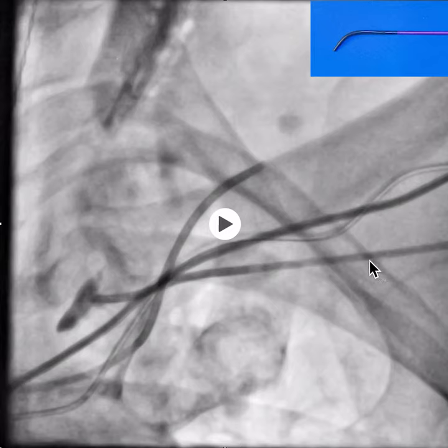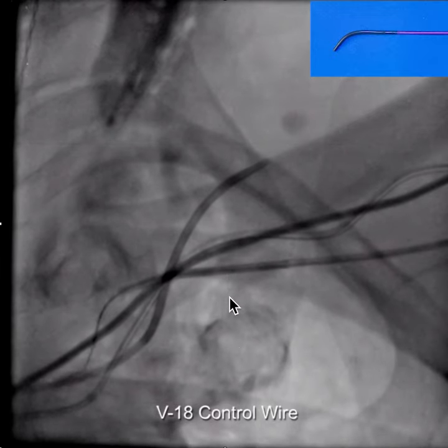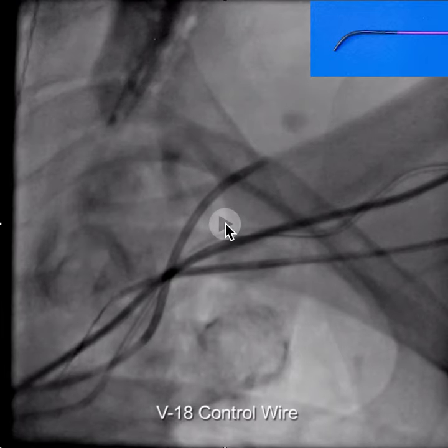This video discusses what balloon to use when you get a wire down through an occlusion. In this case, we're using the KA2 catheter — a 5 French hydrophilic angled braided catheter — and we're able to use that to get a V18 control wire through the occlusion.